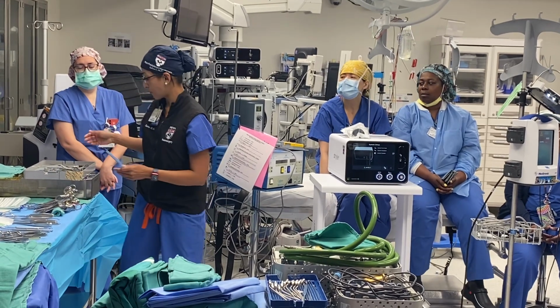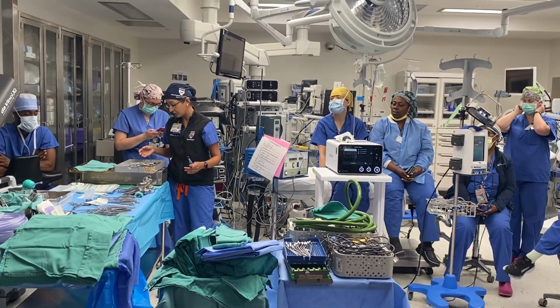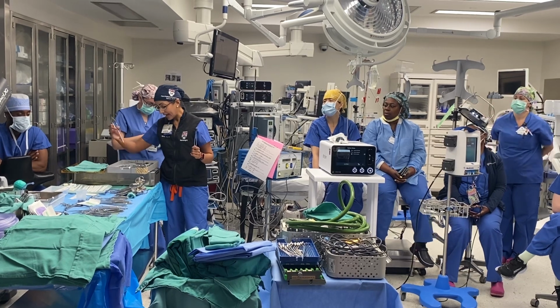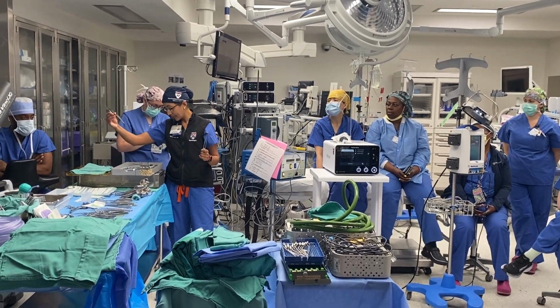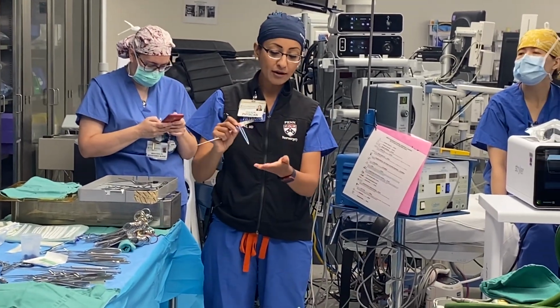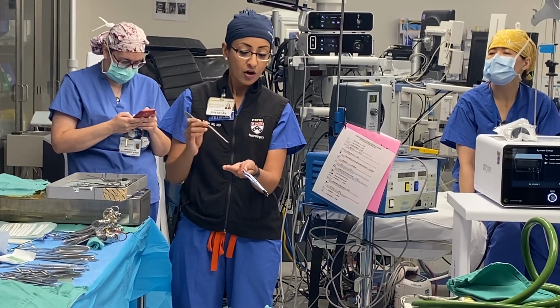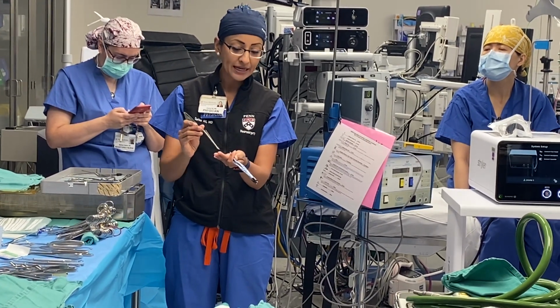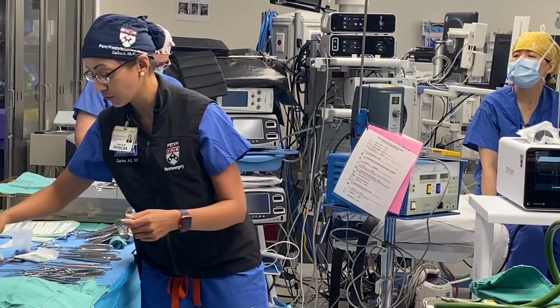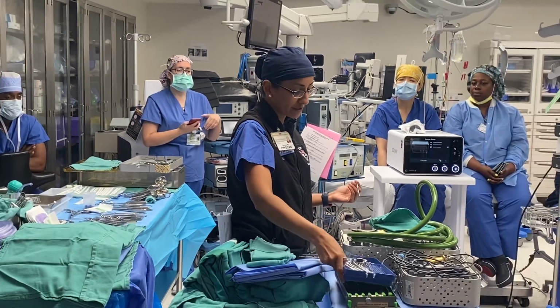At this point, you'll want to have all your Rotens set out. This is all of our micro instruments that we use inside the brain. In addition to this, we'll utilize the micro scissor, which is usually a curved and a straight one. Once we do that corticectomy, coagulating the surface of the brain, we will cut a small opening in that surface, and then you'll see us go back to, we always have two things in our hands, either the 8 French suckers or the vascular suckers.